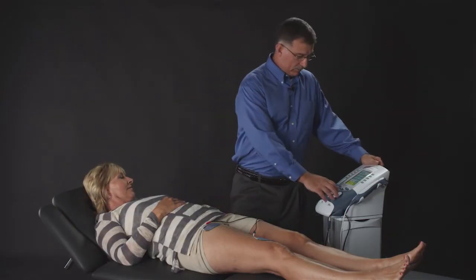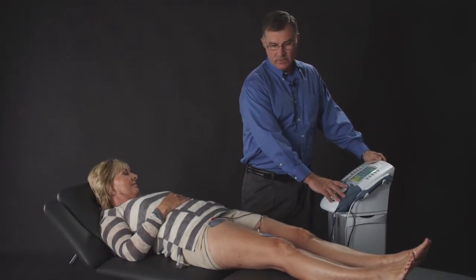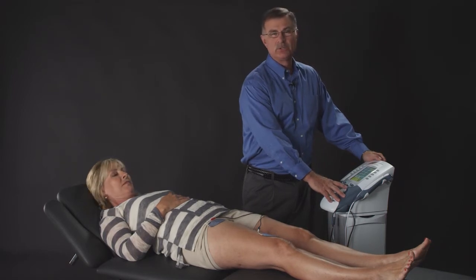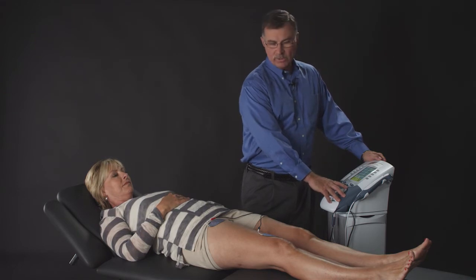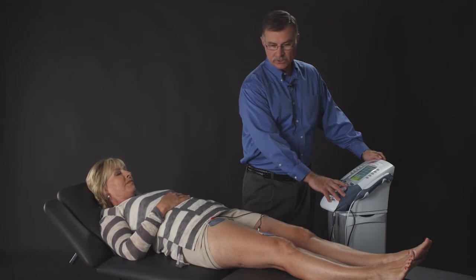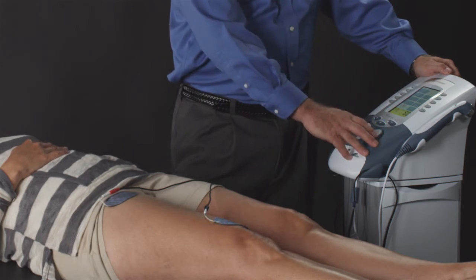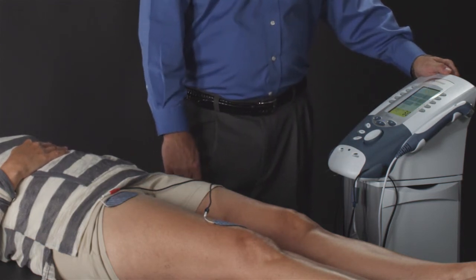Now let's increase the amplitude. We'll now turn up the amplitude until the patient feels it. If this is the patient's first treatment, we will let them feel the current for a little while to adapt to it, to see what they're going to go through. Now we're going to increase the amplitude until we see a visible muscle contraction. Once we get the muscle contraction that we desire, we will press the start key and the cycle will begin.